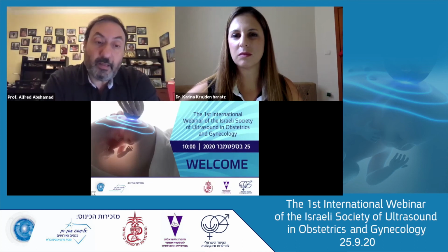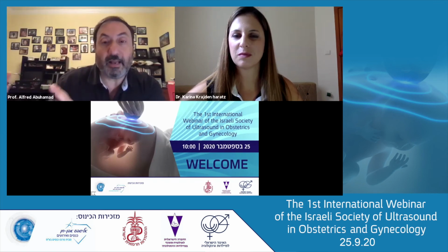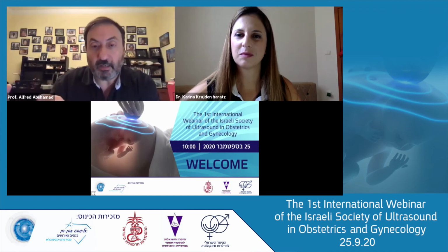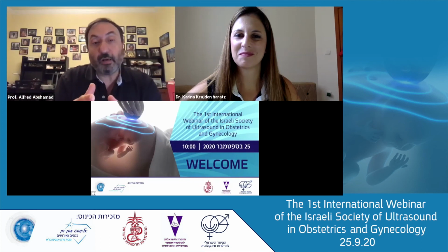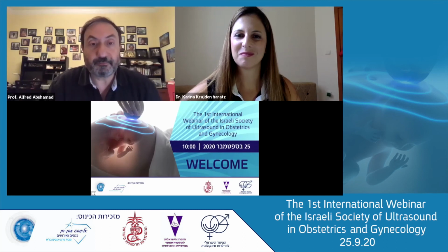So my recommendation for the group on the higher end of the gestational age is, please trust me, look at the literature, look at the large studies that have been done with tens of thousands of patients, and try to move your screening. We're only asking to look at the 4-chamber view, cardiac axis with color, and the 3-vessel trachea view.